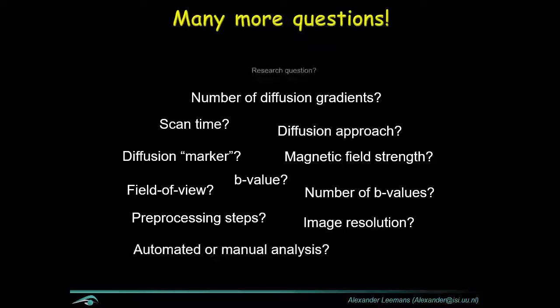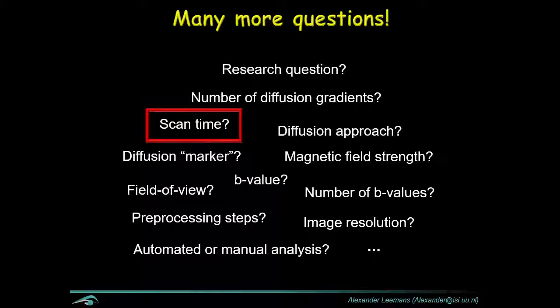So when somebody comes up to me and says, "We want to do this," then we need to actually address all these questions. But I think one of the first ones I tend to ask is, okay, how much scan time do you have? Because if it's somebody from the neonatal department and they're scanning young babies under sedation, then obviously you can't scan for 20 minutes there. So that is actually also tied down with the research question here at the top. What is it actually that you want to do? Do you want to investigate some mean diffusivity measure, or do you want a full diffusion tensor or beyond the tensor? Okay, so these are very important questions, and it's all connected.